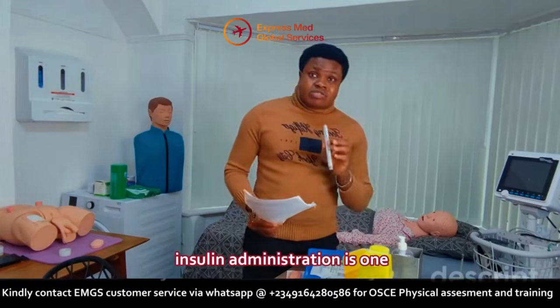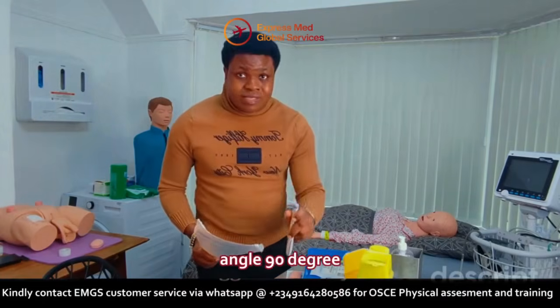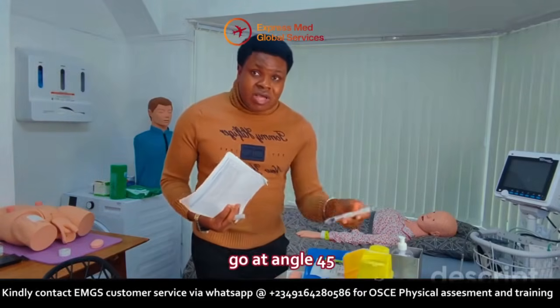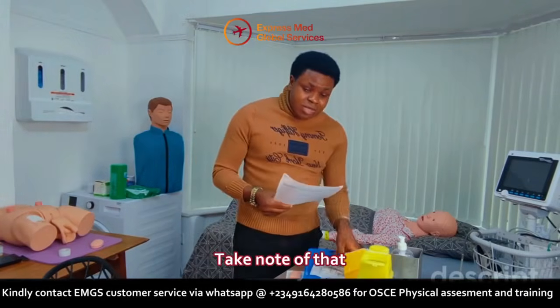Remember, insulin administration is one of the only medications where subcutaneous administration has to go at 90 degrees. Usually, subcutaneous administration goes at 45 or 90 degrees straight, while 45 is just like this. So please take note of that.